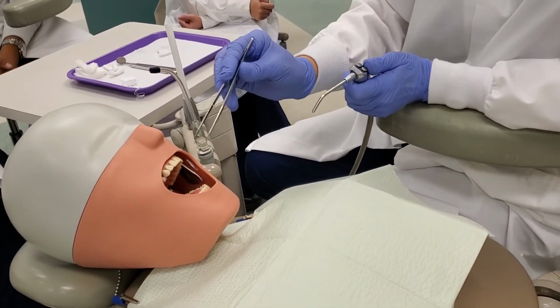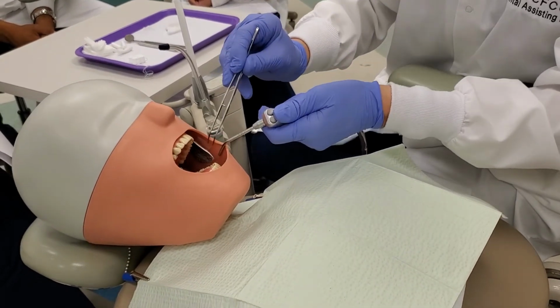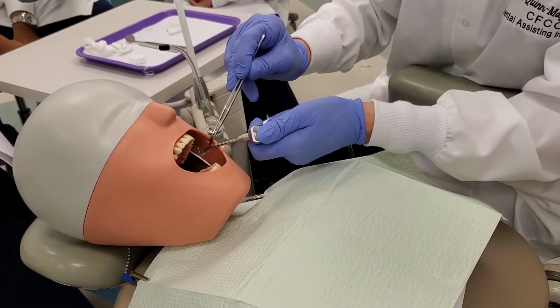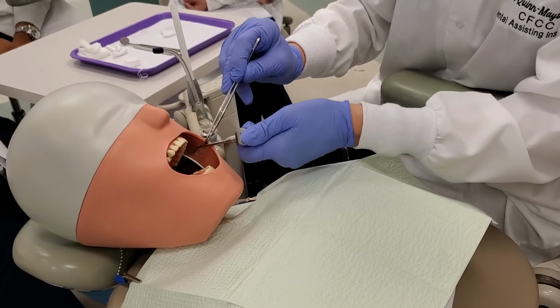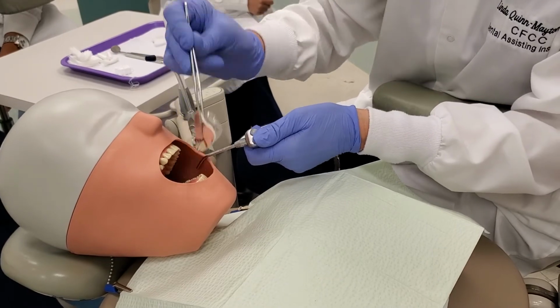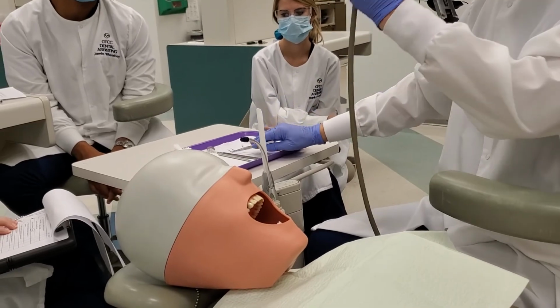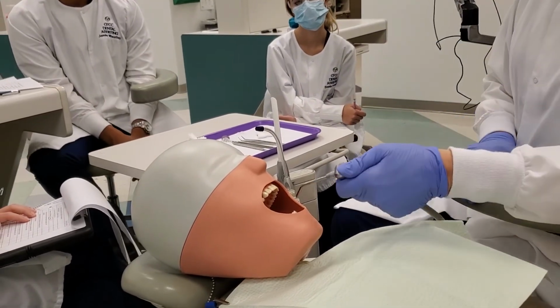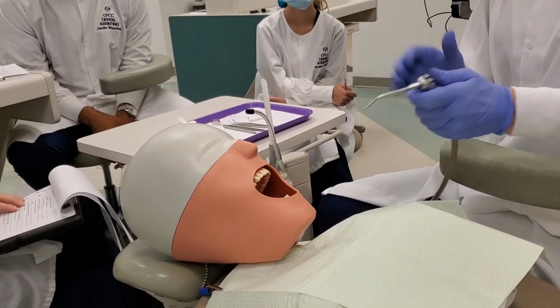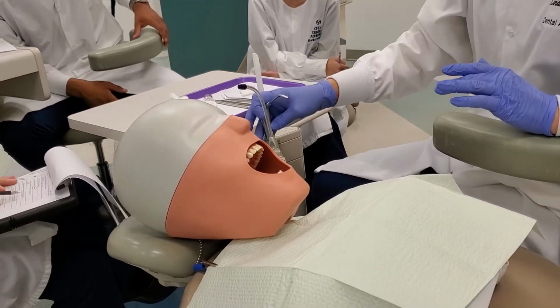For the dry angle, what you want to do is just wet the tip right here, get that wet, wet, wet, and then use your tip of the air water to go up against that sheet with the water on, and you can remove it that way. This thing should be super wet when you bring it out, okay? Because again, if any of that's dry, if you take your tip and slowly work it between the dry angle and the cheek, then you will completely remove it safely, and it'll be all wet. That's the easiest way of doing it.